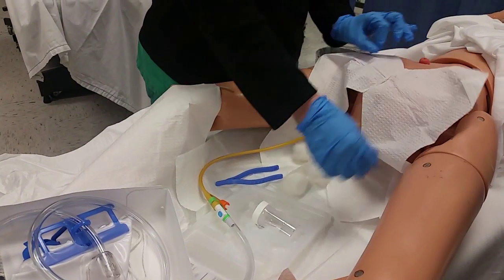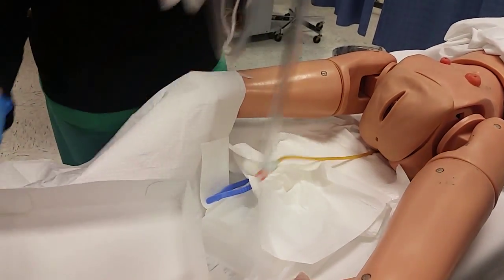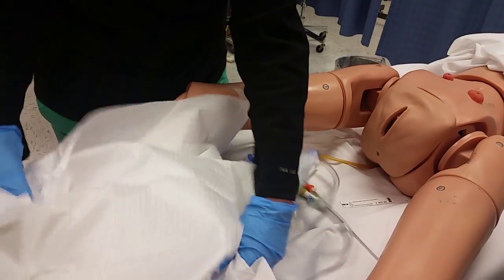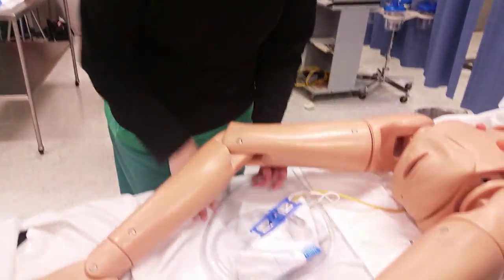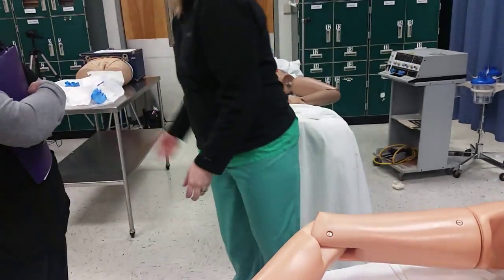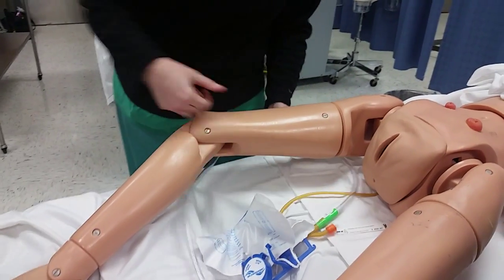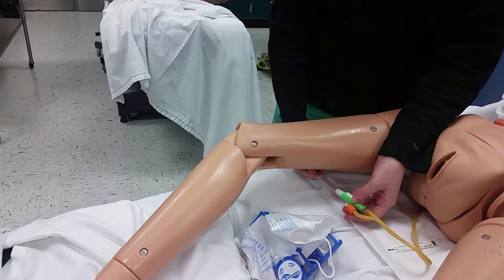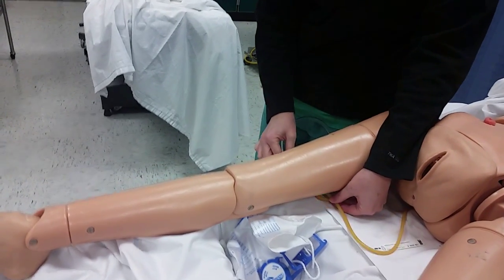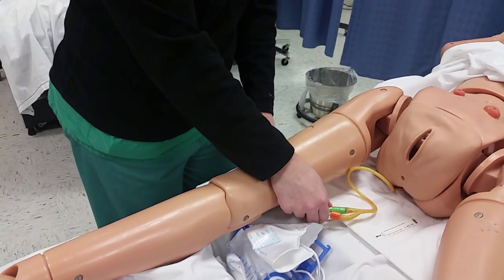Once that's done, you rip this off, wipe off the excess, gather all your supplies. Get rid of all your trash. Take your gloves off because you just prepped somebody's dirty area. If the Foley's just in there for surgery, you can put it under the leg and secure it so that it's not pulling. Be cautious so that the leg does not create pressure. You can secure it with tape, or it comes with a clip — you put those on and attach the actual Foley right here to their leg.